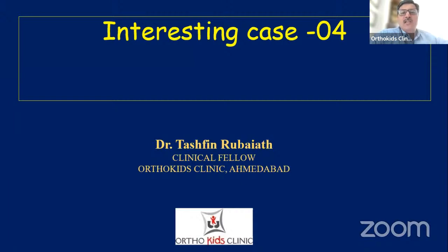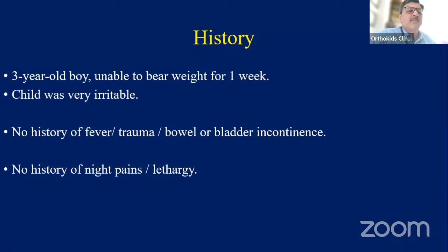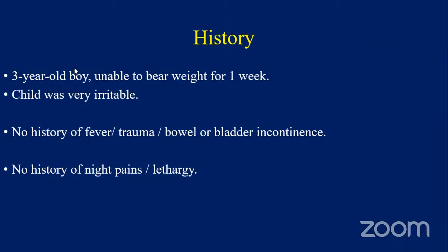Anyways, let's go through these 4 cases. I would appreciate your opinions as a tumor radiologist and surgeon. What is this, Mandip and Malini? Just let us know. Yes, Tashfin, move ahead. Tashfin, are you there? Sir, yes, please go ahead.